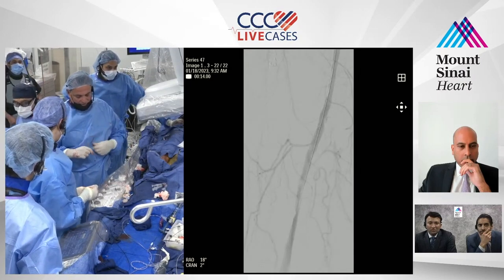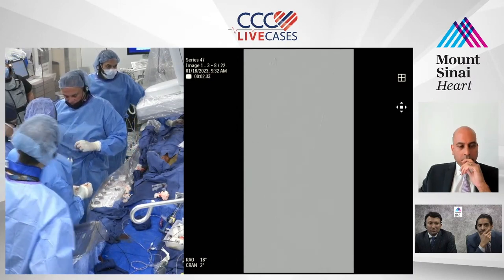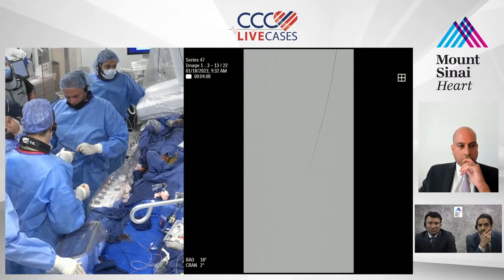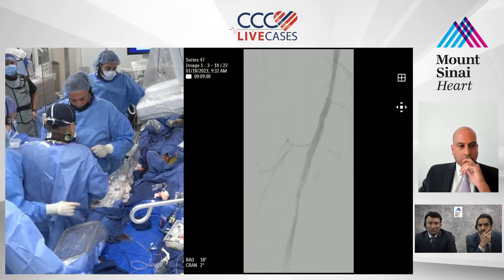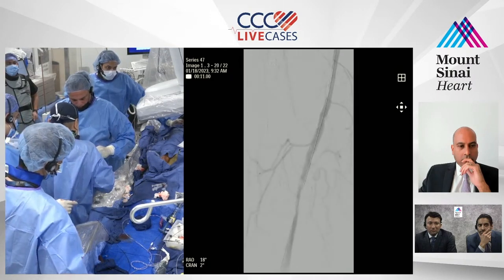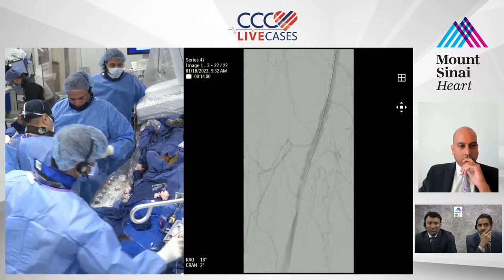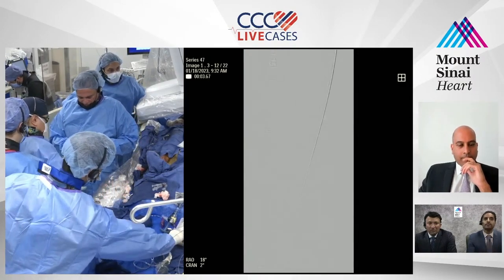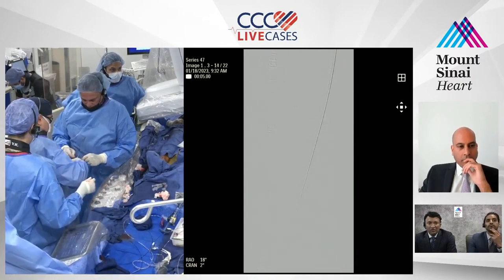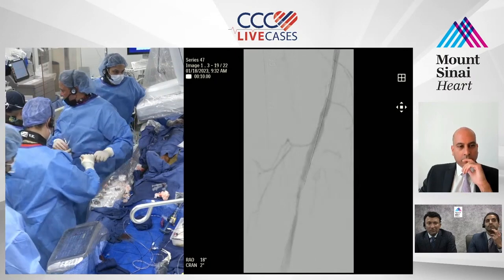So we're dealing with wire issues now, as you can imagine. Cut it right at the black point. It's not cutting. You've got to cut higher, because otherwise you're going to bend it and you can't put it in. Get a couple of forceps.